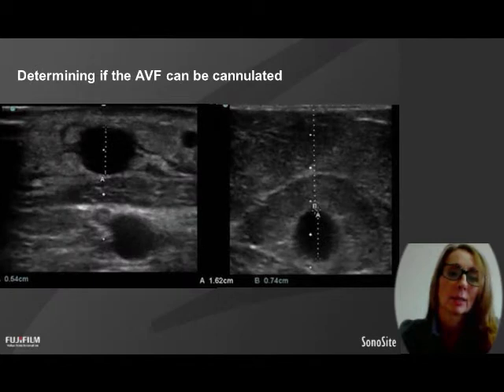This helps even more, as I'm certainly noticing more and more obese patients coming on dialysis. They have fistulas created and they come to us and we're told that we should be able to cannulate them, and it's very difficult to palpate, but we don't know how deep. We just know it probably is deep, but we don't know how deep. So if we don't have ultrasound, we would cannulate in the hope that we'll be able to reach it. And if we had the ultrasound, we could put that on and measure the depth and say from the beginning, it's actually too deep, you need to superficialise it.